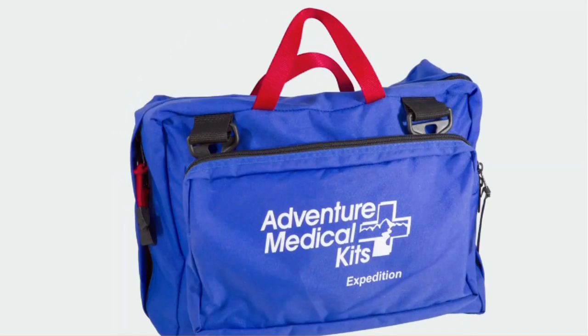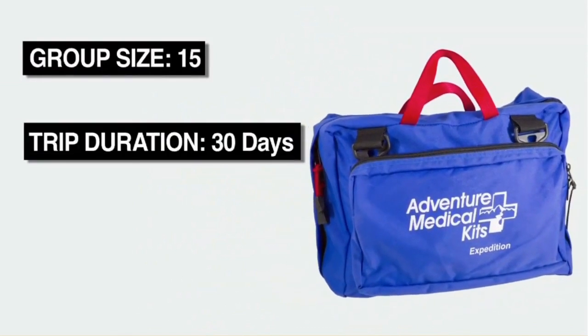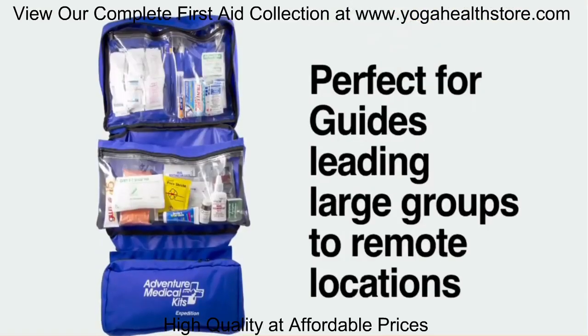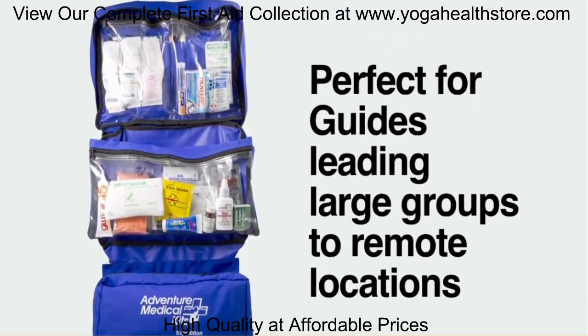The Adventure Medical Kit Expedition Kit is one of our largest kits and is great for groups of up to 15 people traveling for 30 days in remote locations. Originally designed for REI Adventures, this kit is perfect for guides leading large groups to remote locations.